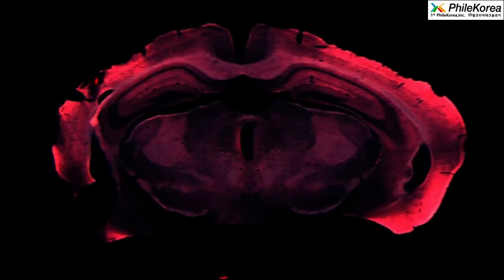And when we zoom in, it's great. Look at this. You can see here nicely also the hippocampus, cortical parts, right?